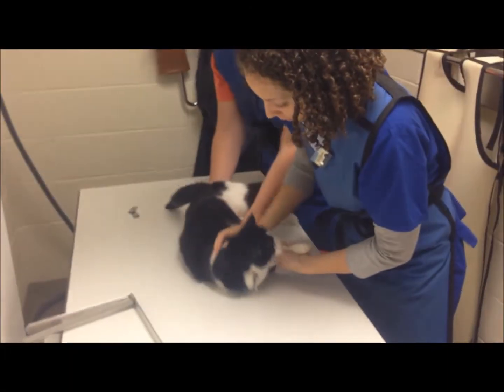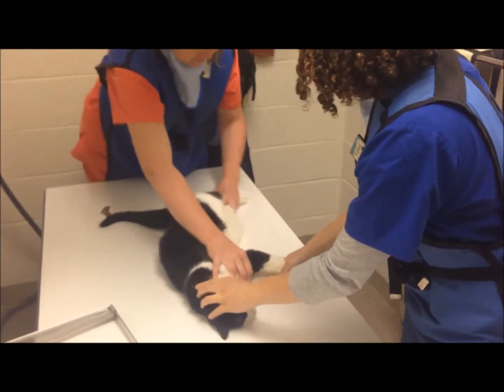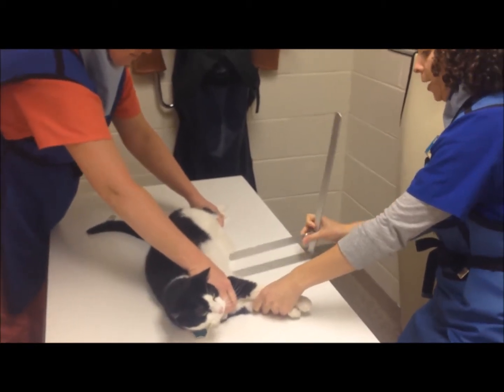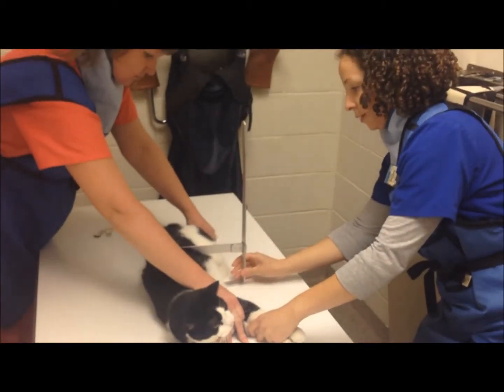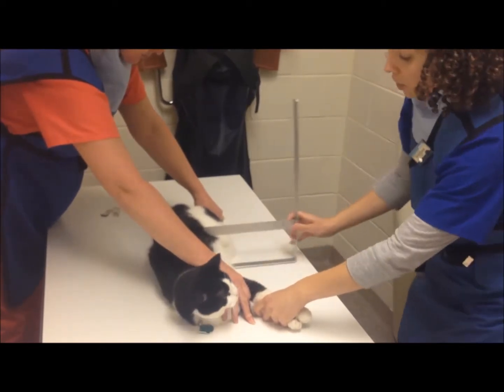Go ahead and get her in position. We're going to do our lateral. So we've got her in that right lateral recumbency here. And then we'll go ahead, and we've got our calipers, so we're going to take our measurement. And we're trying to take our measurement roughly at the level of her liver. So we've got about 8 centimeters.